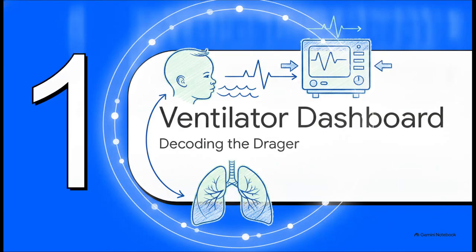Section 1. The ventilator dashboard, specifically looking at the Draeger BabyLog 8000. So looking at the big picture, when we stare at one of these interfaces, we're really just looking at the control panel for a massive feedback loop. We are constantly adjusting what we tell the machine to do based strictly on how the baby responds. It's this ongoing dynamic conversation between the technology and the patient.